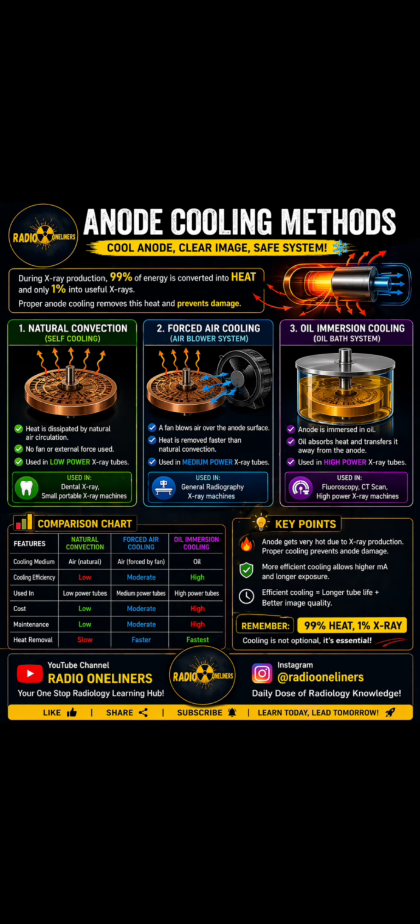If we compare: natural convection, slow cooling; forced air, moderate cooling; oil immersion, fastest cooling. Better cooling allows higher mA, meaning you can use larger exposures like kVp and mA and longer exposures, which improves image quality. Efficient cooling provides longer tube life along with better performance of the tube. So this is all about anode cooling methods. I hope you understand the topic. Please go through the notes which I have already mentioned in the image and you are ready for your exam.